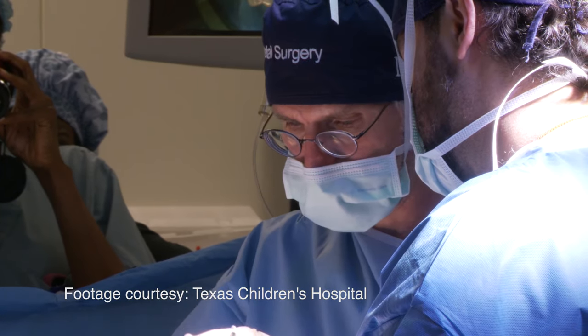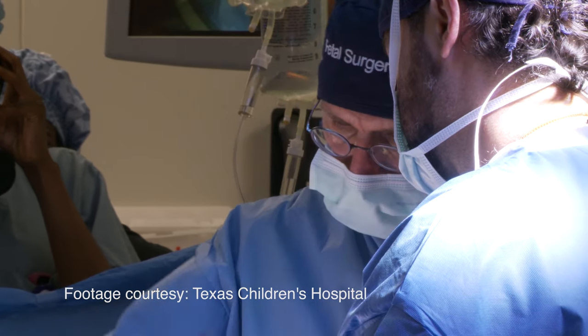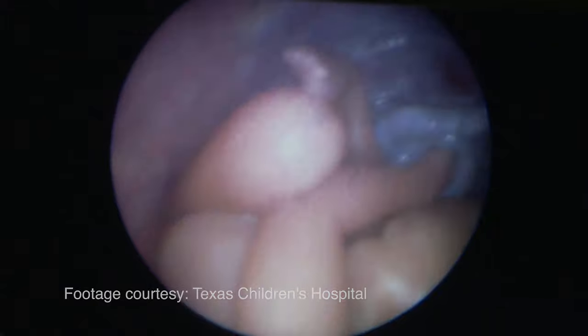Especially for the intervention that we are developing here in our hospital at Texas Children's in order to perform a fetoscopic repair for NTD fetuses.